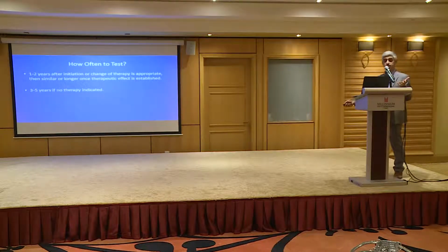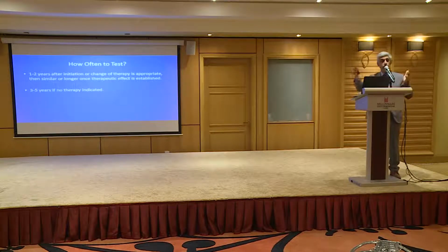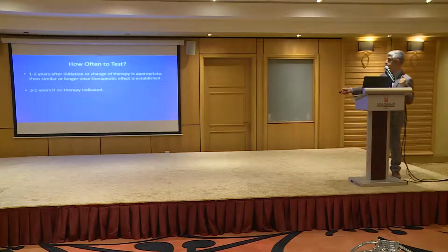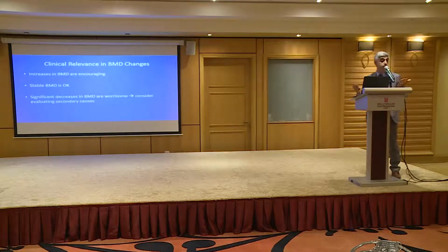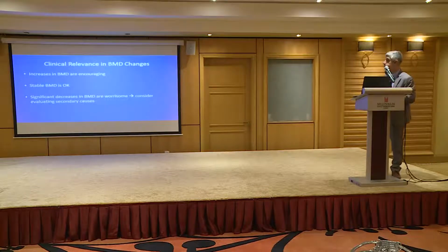How often do we test? We test about 1 to 2 years after initiating or changing therapy. Then similar or even longer intervals if needed. If no therapy is indicated, it still depends on the clinical scenario, but maybe somewhere between 3 years up to 5 years. Clinically, an increase in BMD is encouraging. It tells you that probably things are going well with this patient, if everything is done correctly. A stable BMD is also okay, but a decline or decrease in BMD is a problem, and you have to look for reasons. If they are on therapy, you need to look for compliance. If they're not on therapy, or even on therapy, you need to look for secondary causes of bone loss.